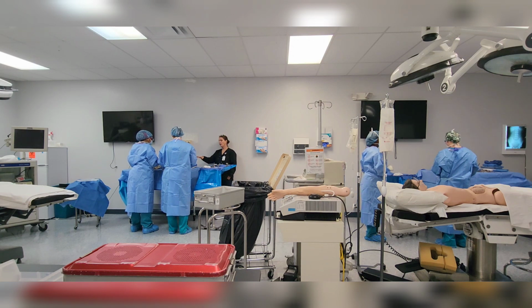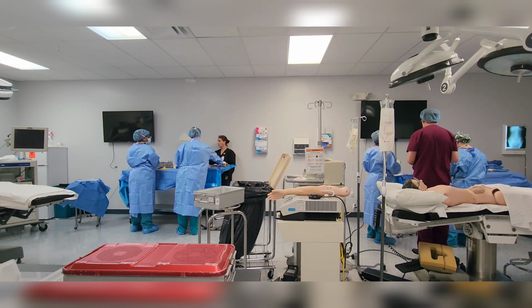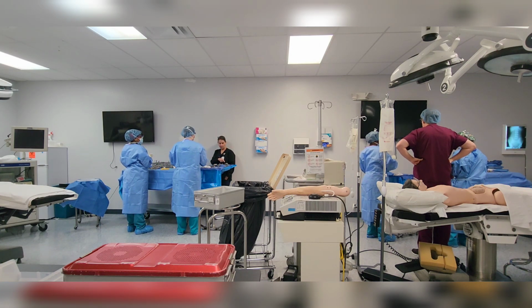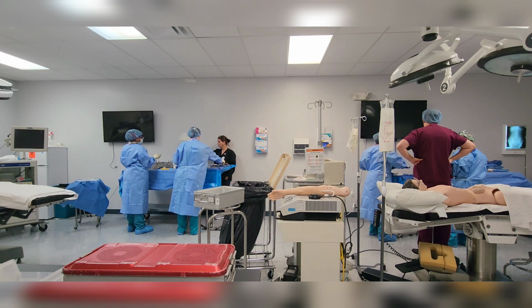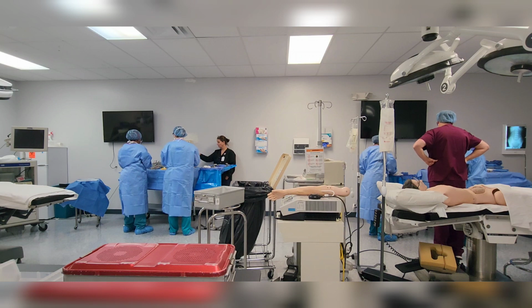So that's how you also do your gown and gloves for the surgeon. Towel, gown, gloves. That's good. Then that way, are there any needle holders you want to keep back there? You want to load your needles, simple. Load your needle, and your sutures back there in an order.